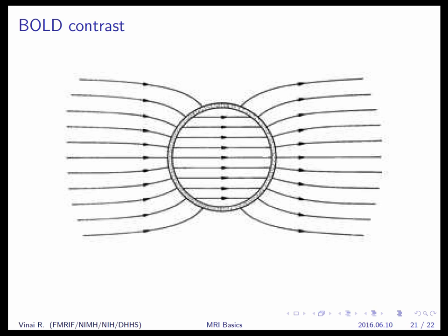So again, it will be protons that essentially lose coherence with each other. That's T2. But because now there's an additional background gradient in the magnetic field, they're losing coherence even faster. Why this is important for us as imagers, it means by the time we get to image this, there would be less signal than there potentially could be if this field were more uniform.